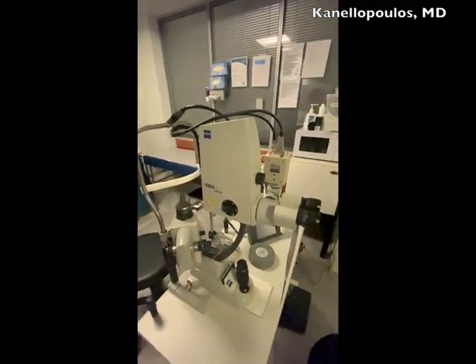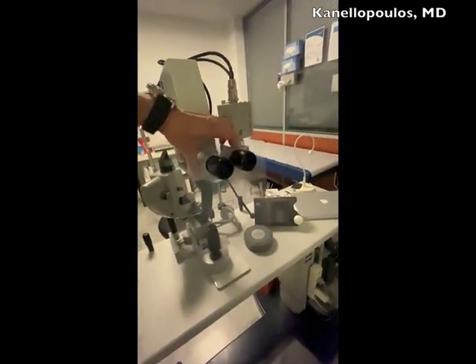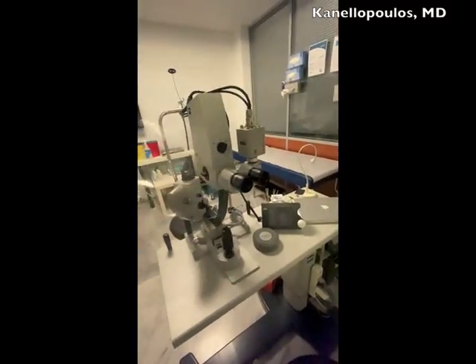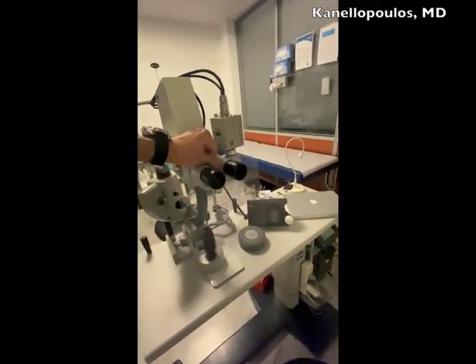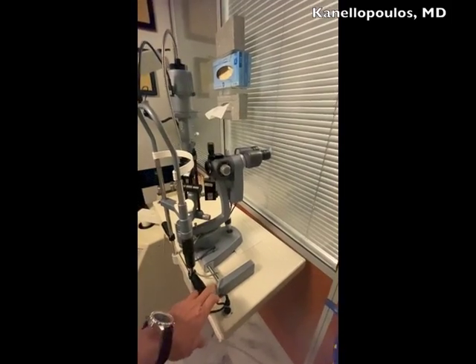Same thing here with a Visulas laser. Again, you can see how easily this can come out. Pretty much fits in any microscope, more or less slit lamp. Come in, position in place, and then adjust the pupillary distance. We have several of these.